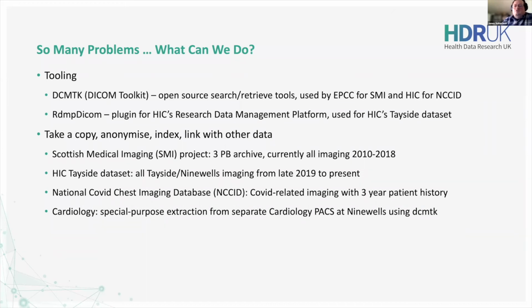DICOM has evolved over the almost 40 years it's been in operation. It's extended. There's even a security variant, DICOS, which handles things like airport baggage CT scanners, because obviously those are CT scanners, but they're just being used in a different role. So there's a slight variation of DICOM for those purposes.